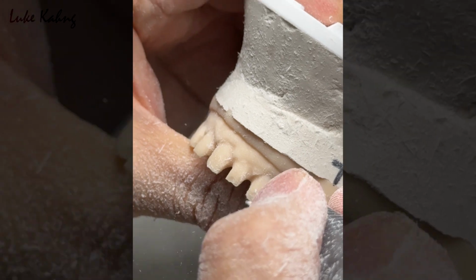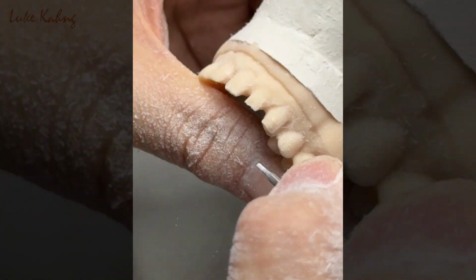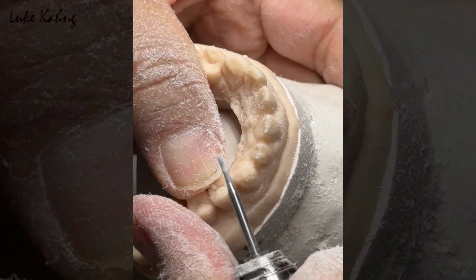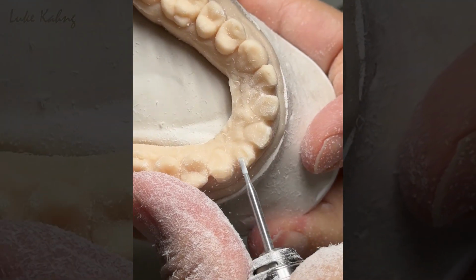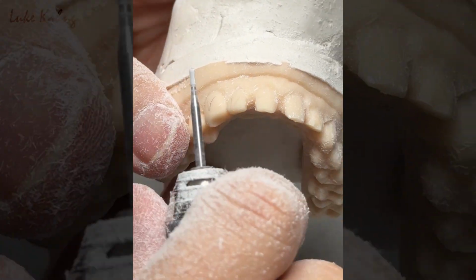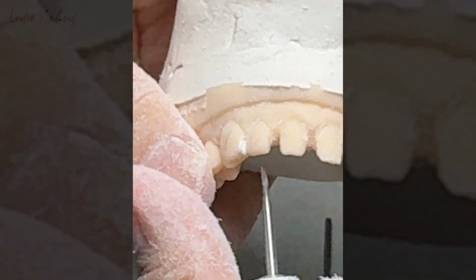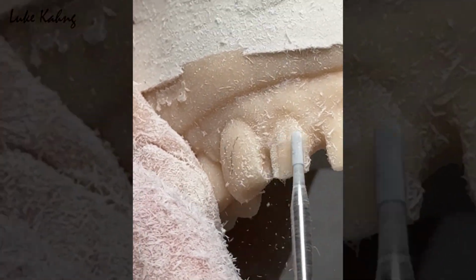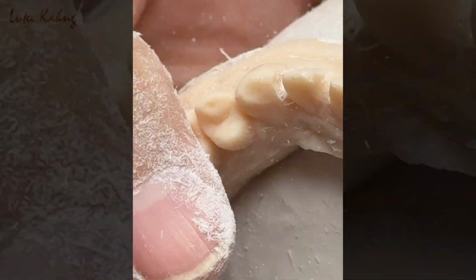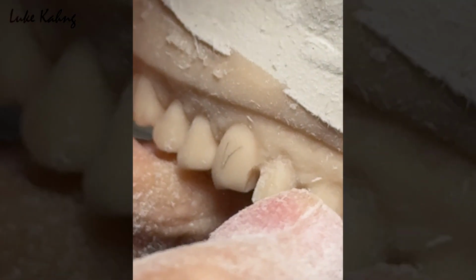And then incisor, cut it. So my margin line is here. Make it a little smoother. Okay, same thing in between the teeth. Open because this is too small in width. I have to make the same good symmetry in between the teeth. Same here.